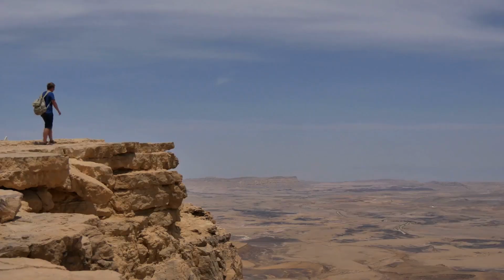Now, this is quite obvious, really, if you imagine that you're walking along a cliff edge. If you can see the edge of the cliff, you don't need to be told, don't fall over the cliff. It's part of how you calculate your way of navigating. So the last thing you should always do before you inject, and I still to this day do this with every injection, is picture the dangerous things I don't want to hit, and that automatically informs your technique. So it starts with anatomy, and that continuously evolves because you keep adding new layers to it.